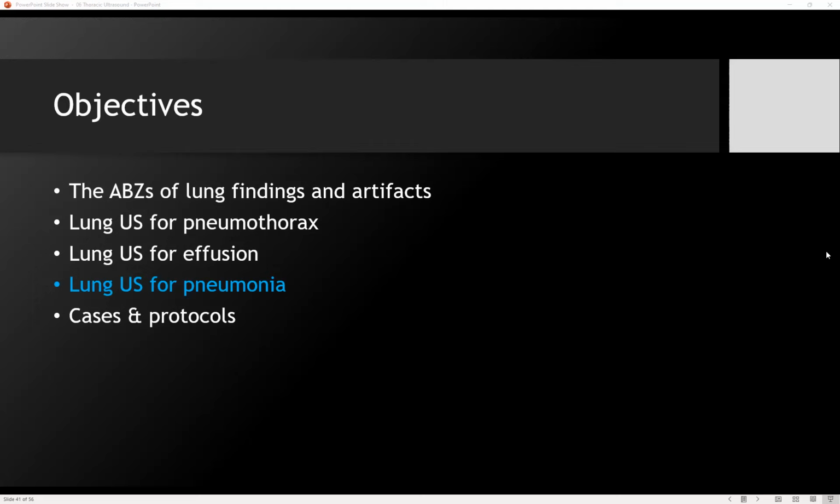Thank you. That's helpful. Sometimes I think, especially if you're using your abdominal probe to do, let's say, a FAST exam. I haven't generally had issues using the cardiac probe, to be honest. In my practice, I still use the cardiac probe, just with the presets for the settings. I generally just still use the cardiac probe, and I haven't had issues. I'm usually on cardiac and then I just use it to scan over the lungs, but I've never played with it if people have issues.